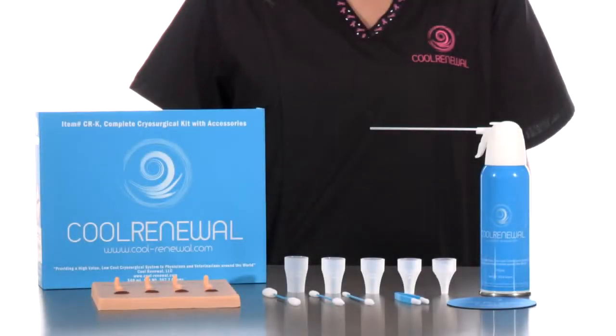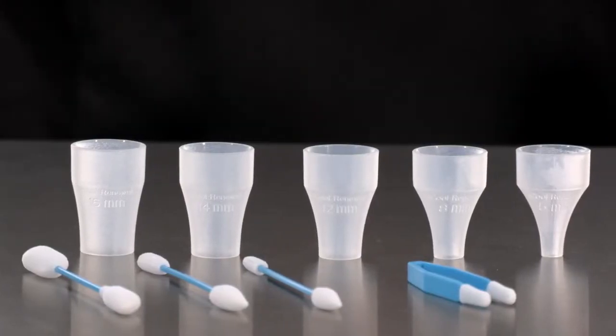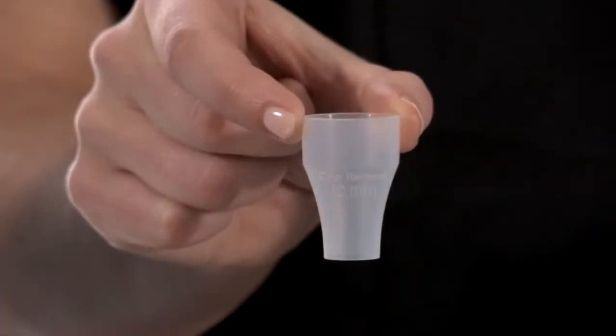COOL Renewal is a convenient and cost-effective alternative to traditional liquid nitrogen methods, as well as other expensive portable cryosurgery systems. COOL Renewal offers a wide variety of new and unique applicators and the lowest cost per treatment available.